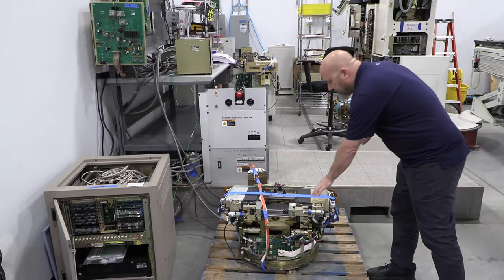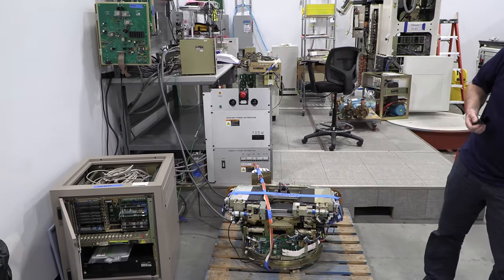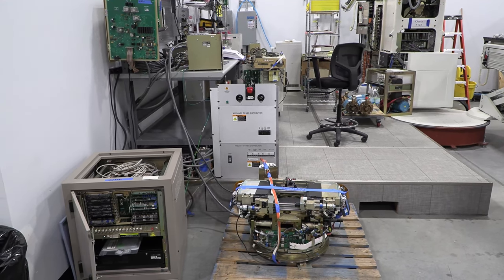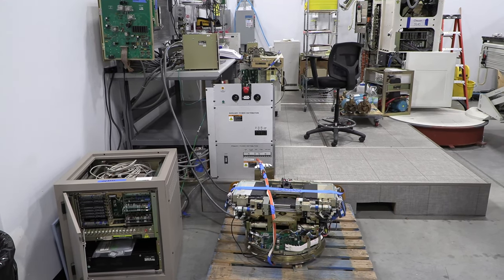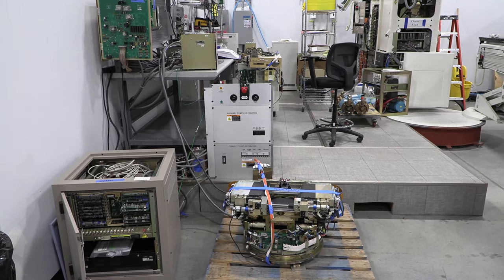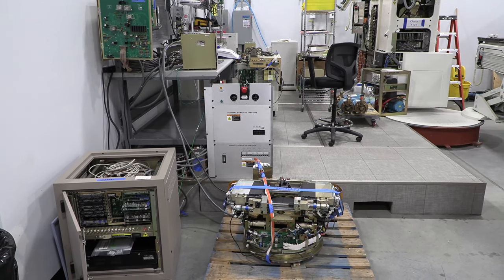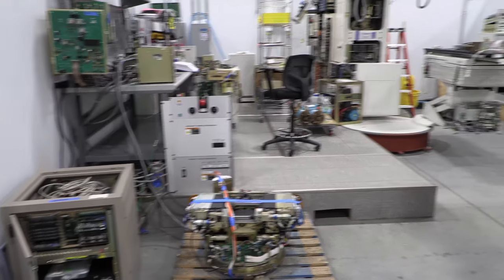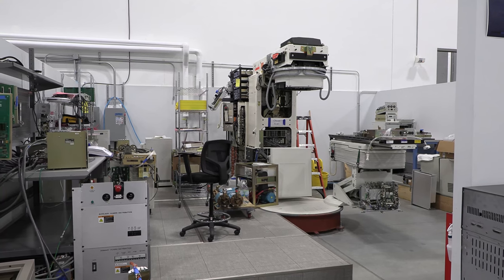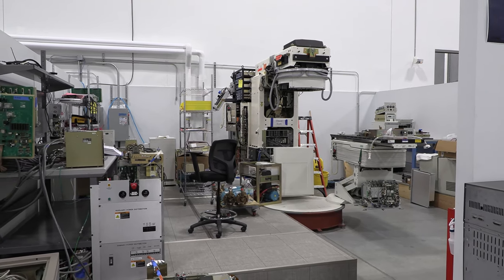That's how I think of things, in terms of the cost and weight. I think that's like 1,500 pounds, something like that. Holy cow. It's tungsten. And there's a lot of moving parts inside that. I can tell by the ball screws. About 600 some parts just in the MLC alone. Wow. That's counting every leaf or motor or spring. Actually, no more than that. If it can go along, it will.